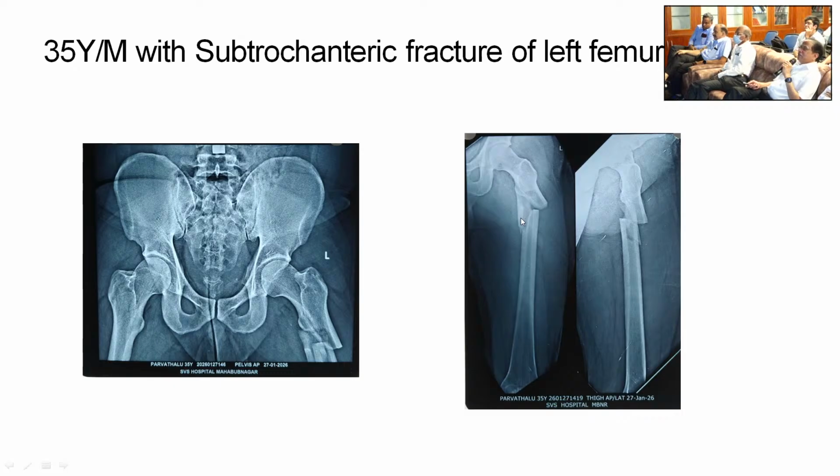I know this is also a difficult subtrochanteric fracture, but the whole idea is you have to neutralize. Then only the implant will work. Plate.